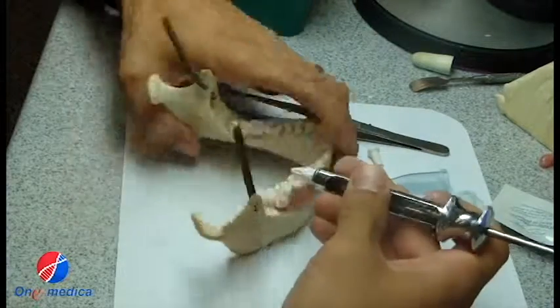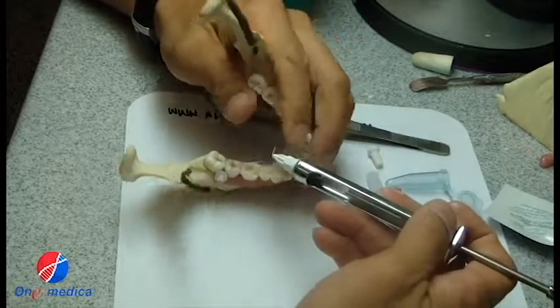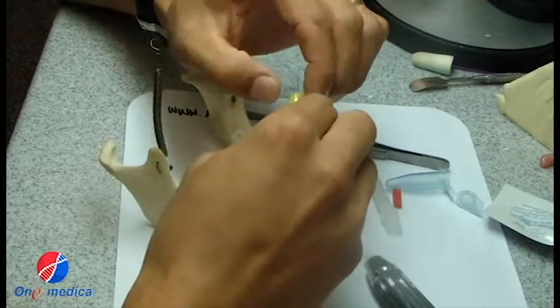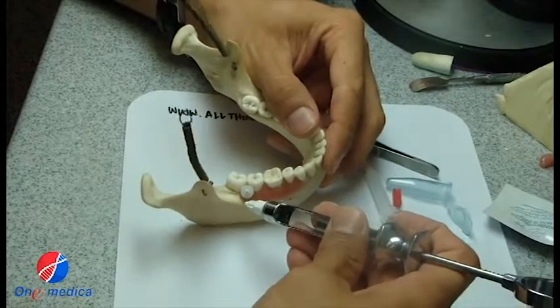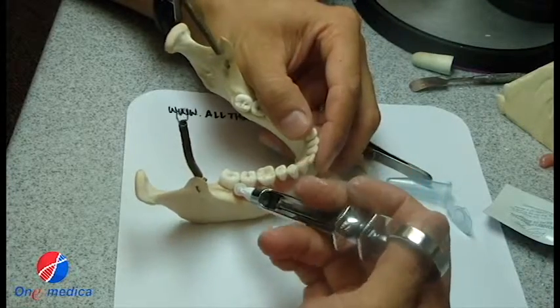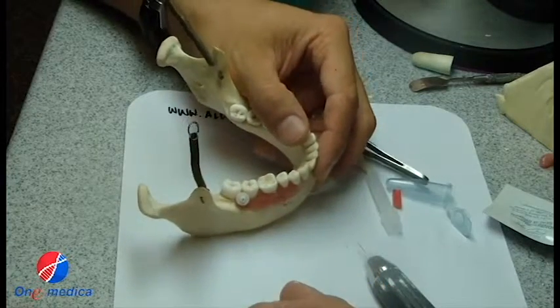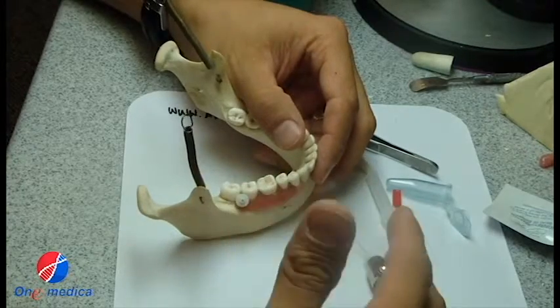You can use any 27 to 30 gauge needle to get in there. This is short, it should actually be longer. You can use any regular gauge. I'm just using this for experiment only. Just place it in there and place your local anesthetic. And you can leave the perforator or the sleeve in throughout the procedure, and as you need to, place local anesthesia intraosseous and use it that way.